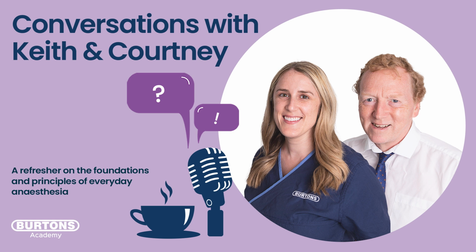And I think all we need to be mindful of is that a buildup of argon is going to displace the amount of oxygen available to our patient over a long period of time at specific flows. So when you're using an oxygen concentrator with a circle system, it is recommended not to go lower than 0.5 litre per minute, which I don't think many of us are doing anyway, because we might not have vaporizers that can deliver an accurate concentration that low.